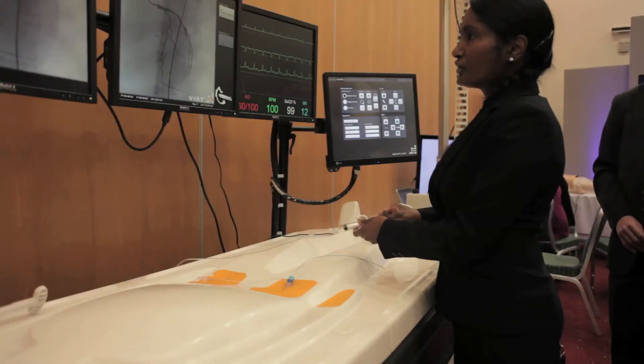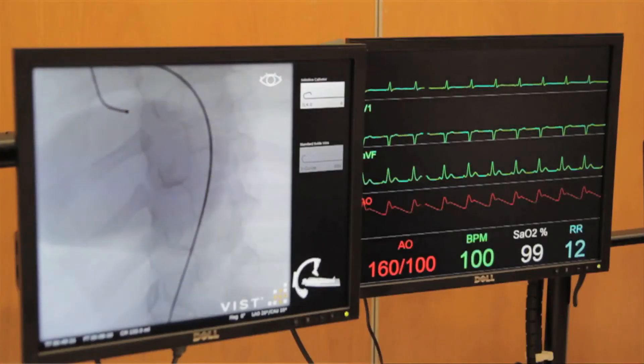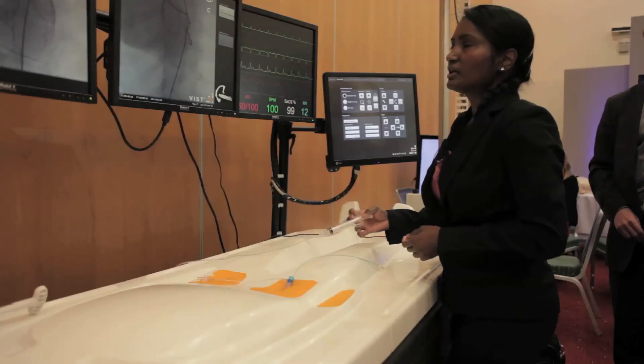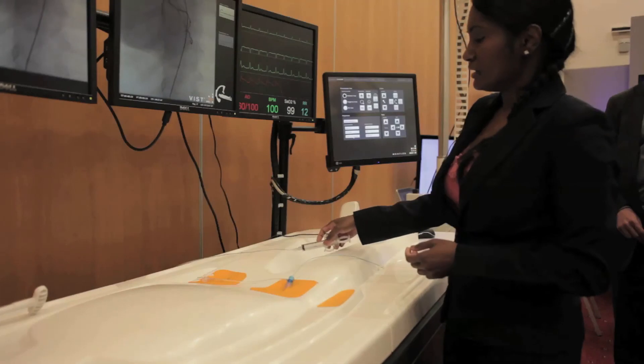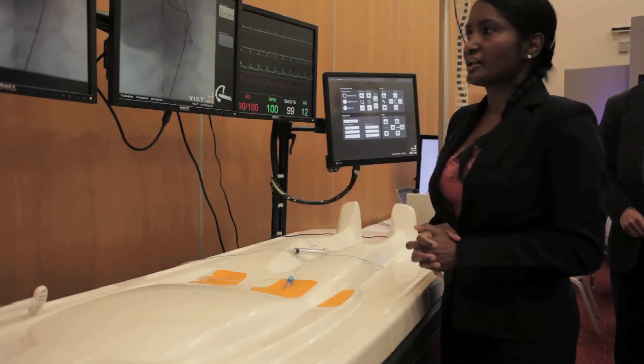And then a caudal, LAO caudal view. Excellent. Excellent. So that gives us pretty much a 360 degree view of the entire left coronary system.